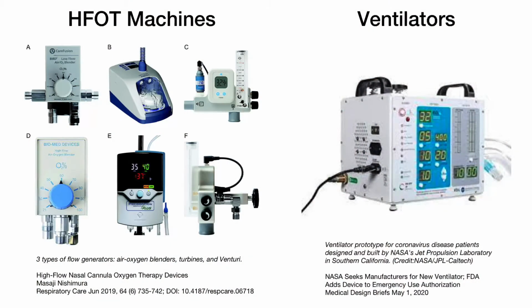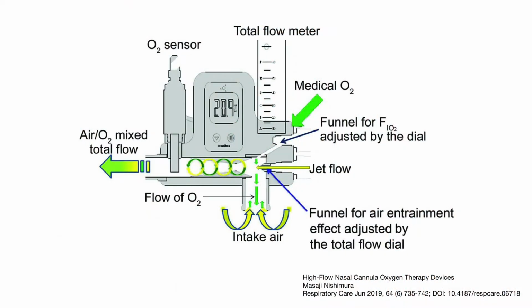When the pandemic hit, high-flow oxygen therapy machines and ventilators were in huge demand across various hospitals and makeshift facilities. However, many of these machines required complex calculations, which made it much harder for them to be used in time-sensitive, stressful situations like those seen in an overflowing ICU. I worked with industry experts in India to help develop and release the first iteration of the app in September 2020. As the virus adapted, my app did too.